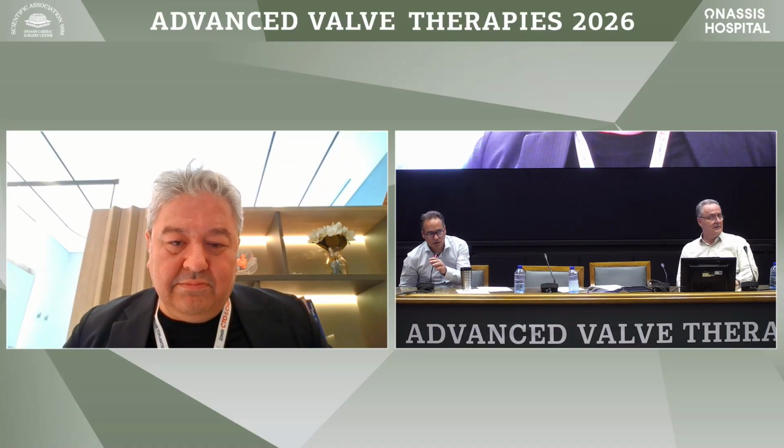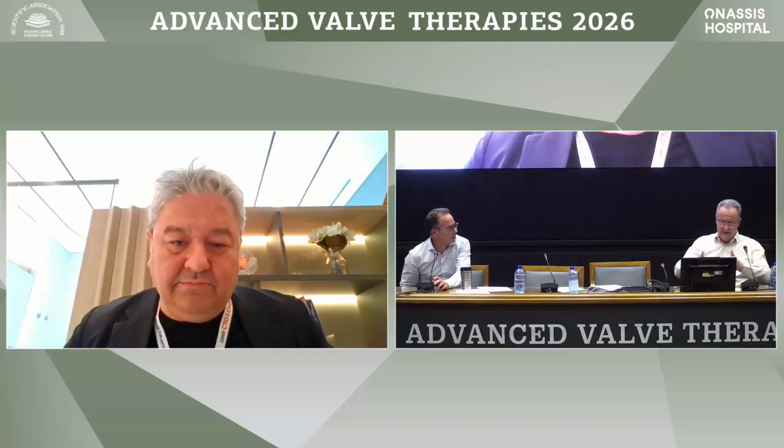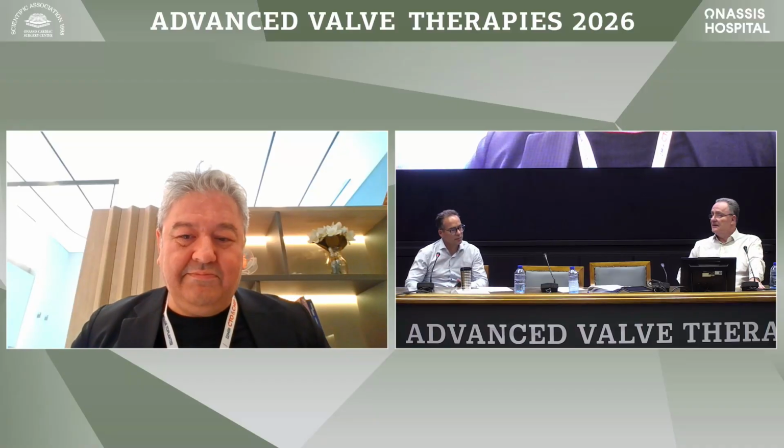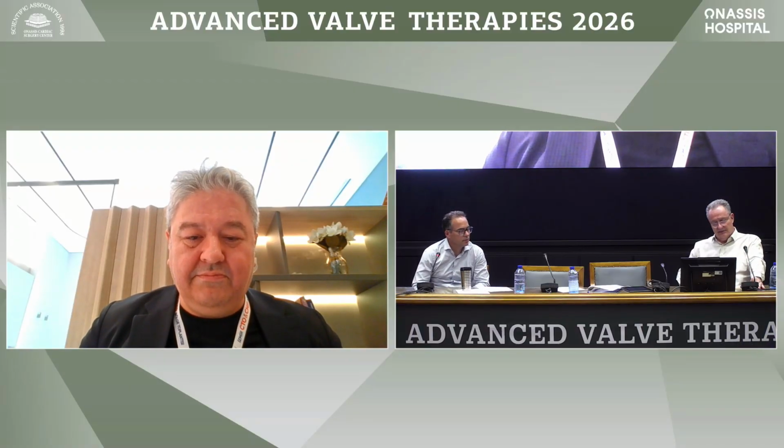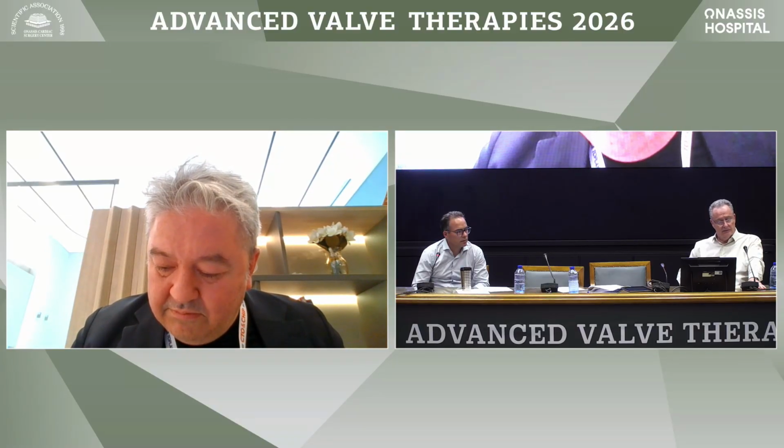Is there any comment from the audience, or is somebody who would like to say something? No. Dr. Vagianakis says you are in the panel. Do you like to have a final comment? Just want to ask a question. A very nice talk, Dr. Kilic. If the indication for closure of your paravalvular leak is hemolysis, and after closure your patient still has hemolysis, how do you manage this patient?